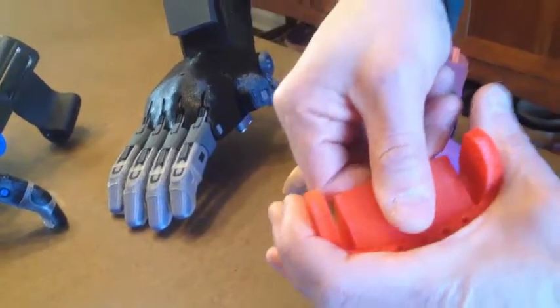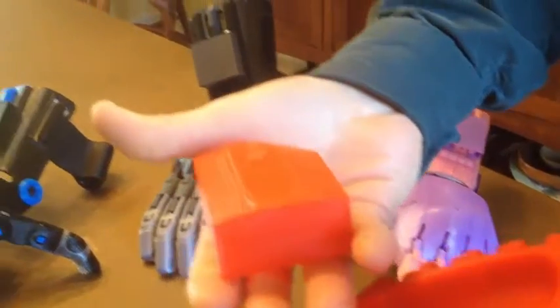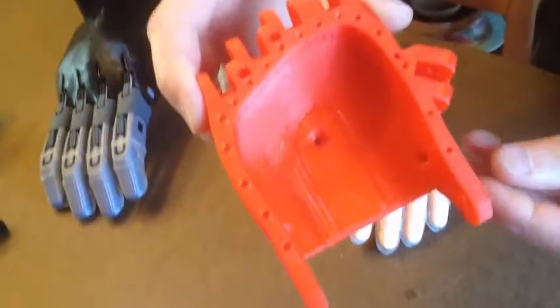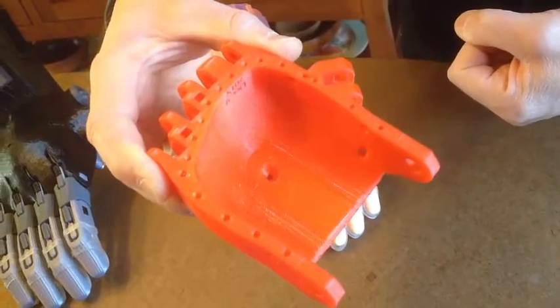Simply grab hold and pull, and at this point you should be able to just snap it out. That can be discarded — that's the support structure — and you'll notice that inside we've got a very good quality internal ceiling to the palm.